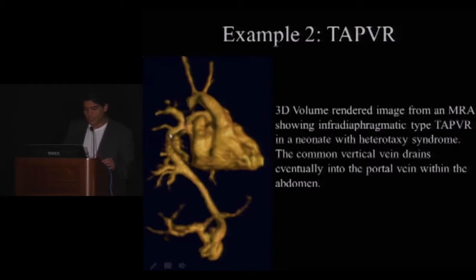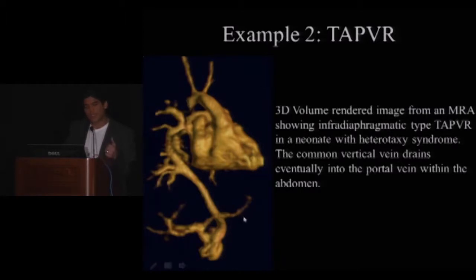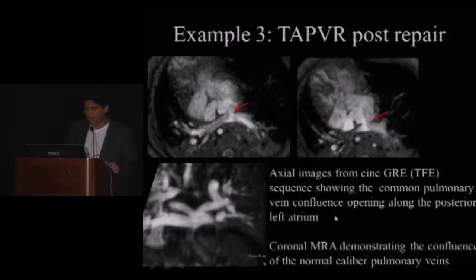In this example, the anomalous venous connection — the vertical vein — extends below the level of the diaphragm and opens into the portal vein. Additional questions the MR angiogram helps answer include the hepatic venous anatomy, bilaterality of the SVC, and the pulmonary veins themselves.